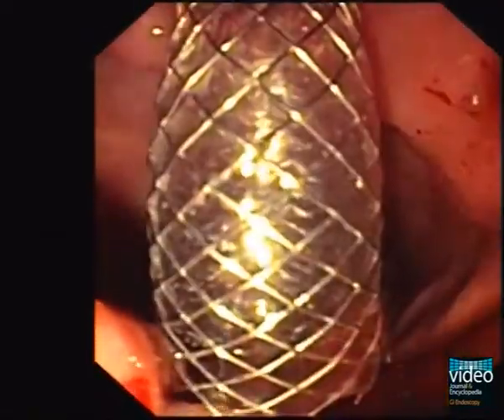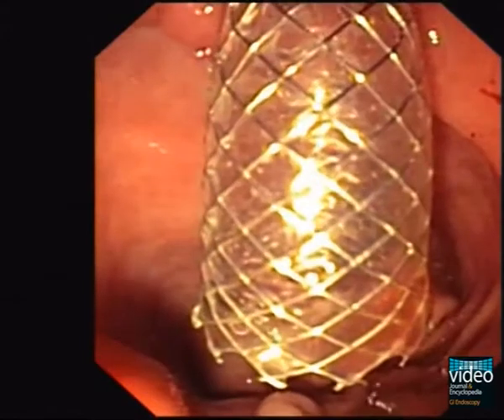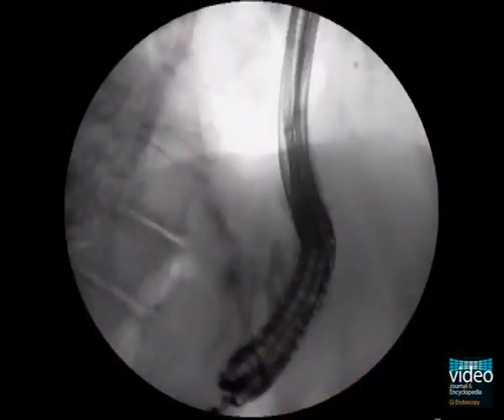The favorable position of the intragastric part of the stent should be nearly 1.5 to 2 cm above the mucosa of the gastric wall within the gastric cavity. There is only a low risk of stent dislocation, since the gastrostomy site is at the posterior gastric wall. Therefore, clip fixation of the stent is not necessary.